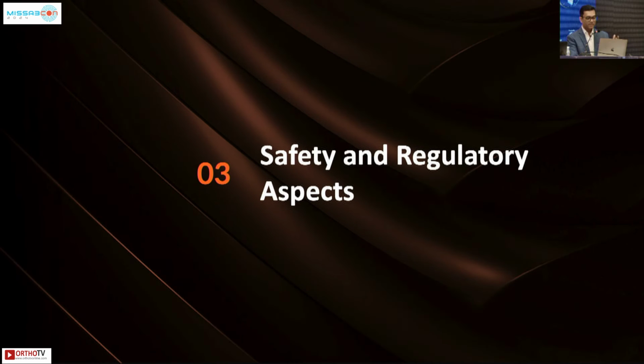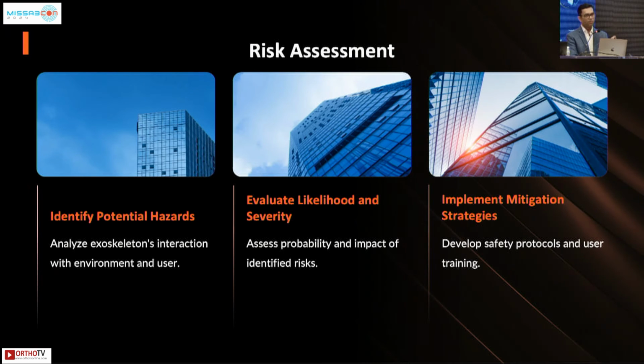The next comes safety and regulations. In India, we do not have any regulations as of now as to how these devices should be designed, how they should be used, and what kind of training should happen. The most important thing is, even though you have this device, these patients need 6 months to 1 year of training wearing this device every single day as to how to use it for safety. And that is the key to the success of these devices.